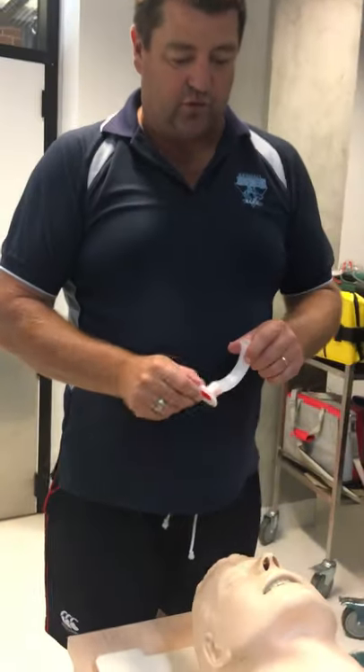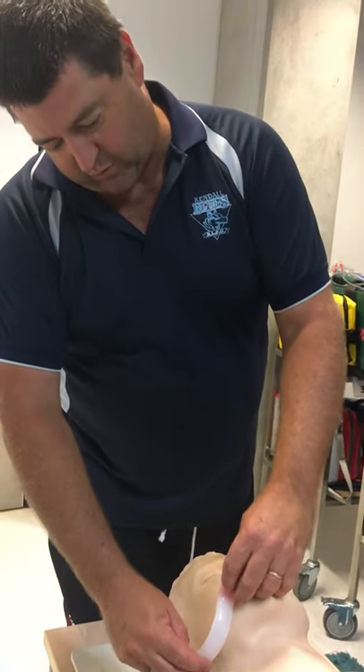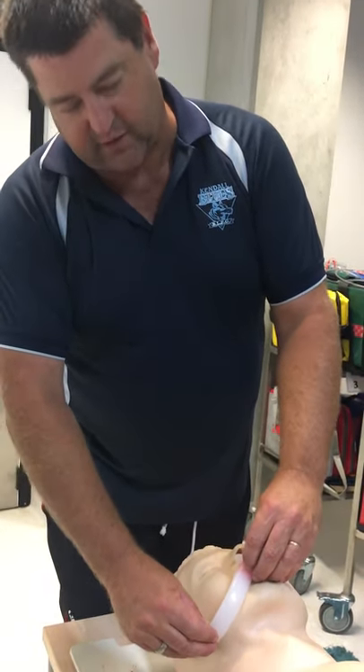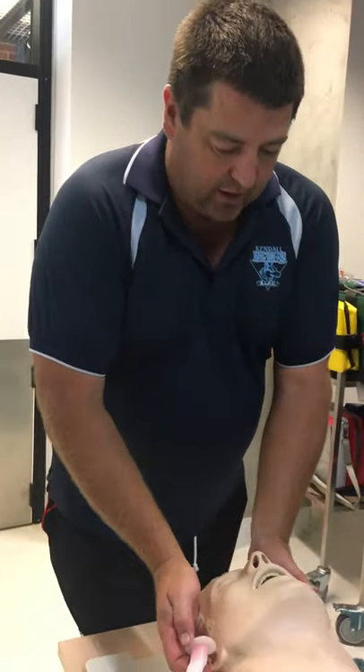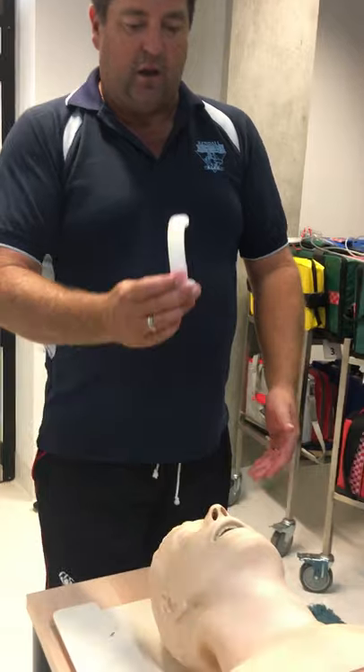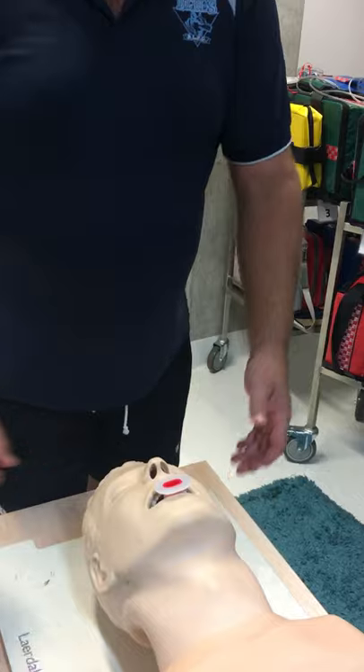OPAs — we measure them up from the corner of the mouth to the ear, or the center of the mouth to the angle of the jaw. With the patient's head tilted, you pop them in upside down to start with and then twist it around and in it goes.